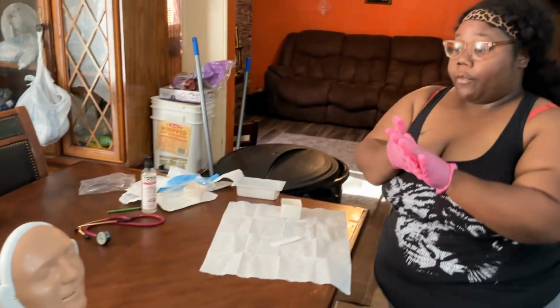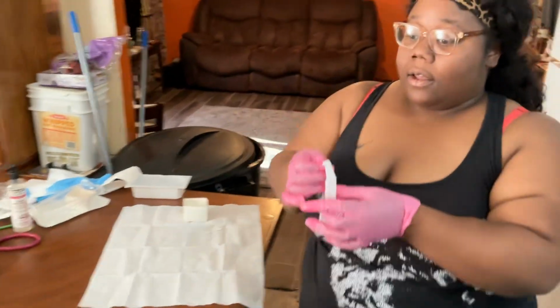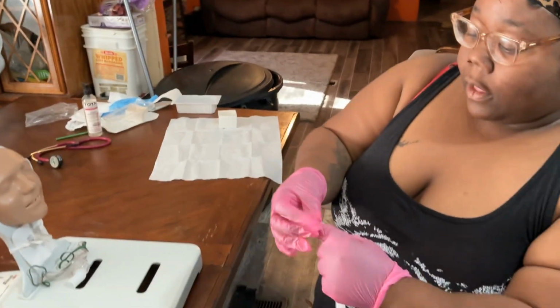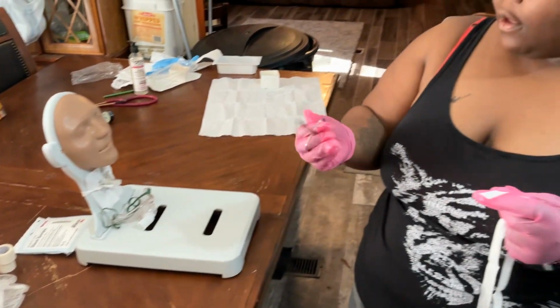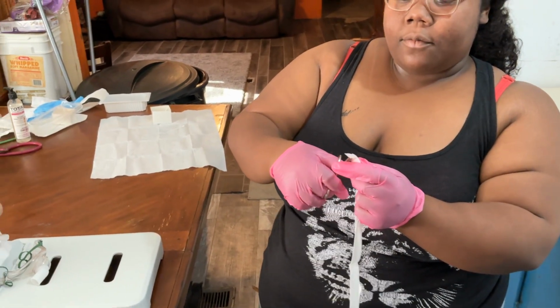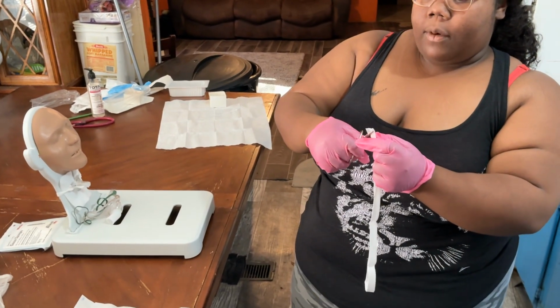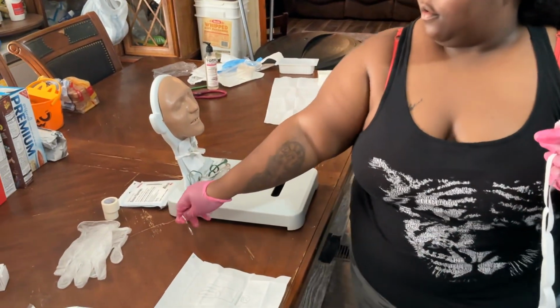So I perform hand hygiene. I put on some clean gloves. I'm gonna take my scissors now. And I'm going to cut this at an angle to wrap around. I'm going to cut this at an angle to perform. Put it around my trach.